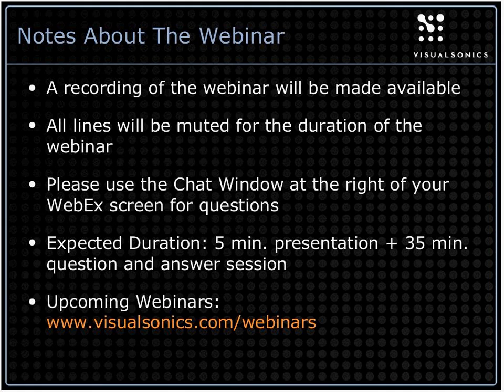We expect a very short presentation today, just about 5 minutes, just to overview some of the basics of cardiovascular imaging with the Vevo. Then approximately 30 to 35 minutes of question and answer session.